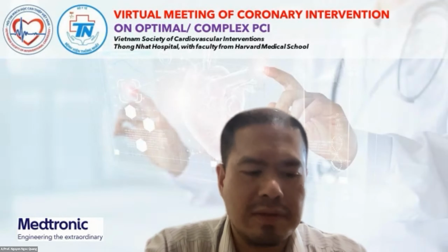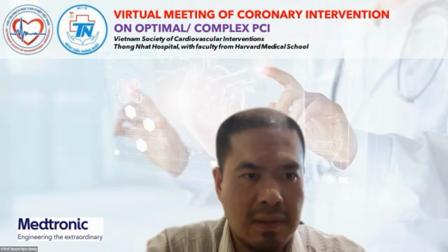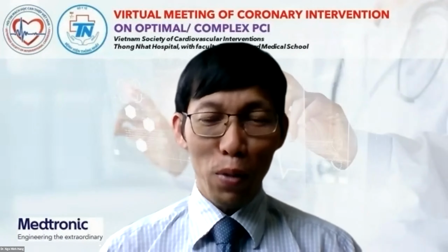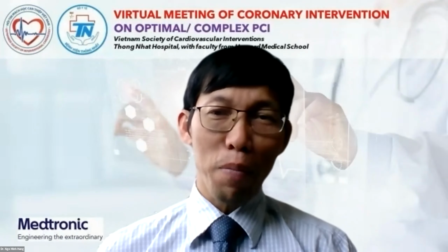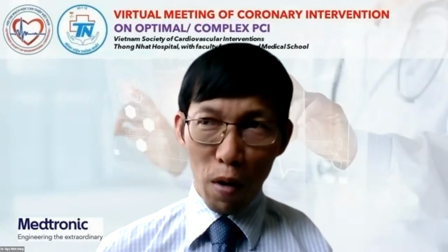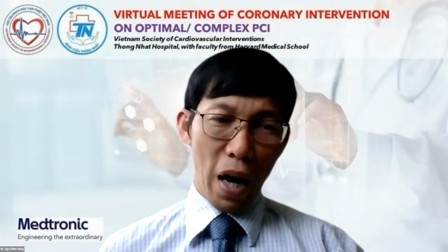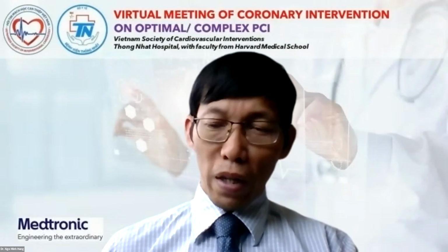So what about you, Dr. Ngô Minh Hùng? Which device do you prefer for complex PCI if you have both? Yes, thank you very much for asking me this question. Actually, in our hospital, we only have IVUS. We don't have OCT, so the choice is only one. But nowadays I use quite a lot of IVUS for left main intervention or complex PCI, although sometimes I cannot use the IVUS for the evaluation procedure. I use the IVUS right away after I do the ballooning, because in quite a lot of lesions we cannot pass the IVUS catheter through the lesion. So IVUS is the only choice in my cath lab.